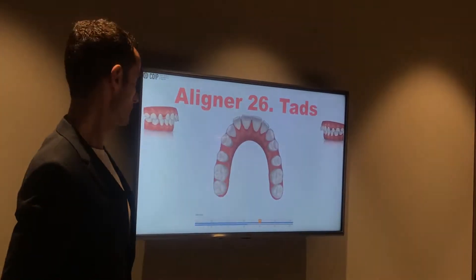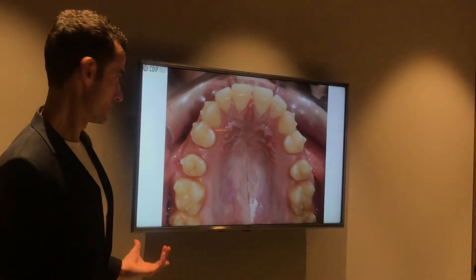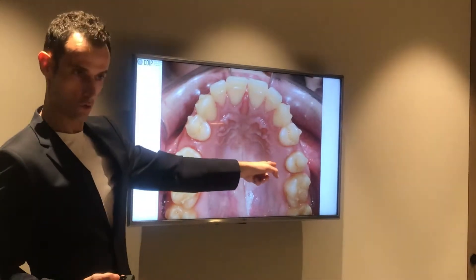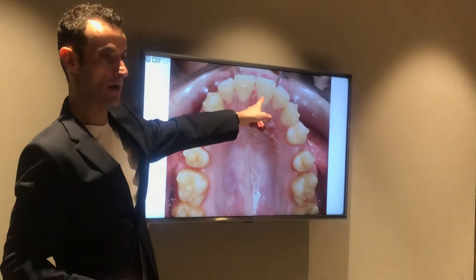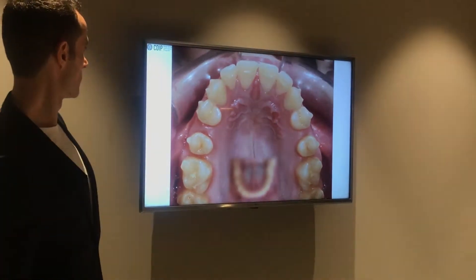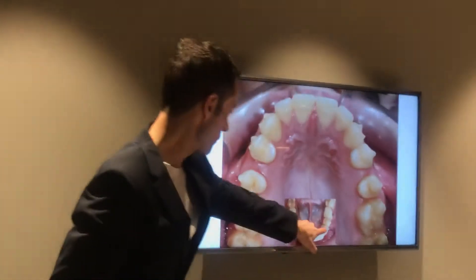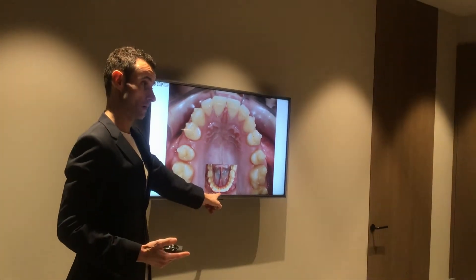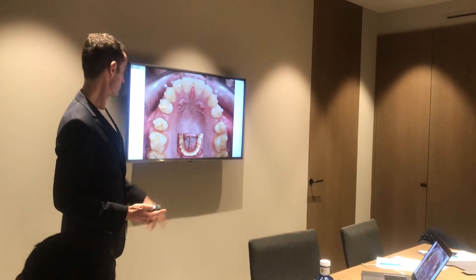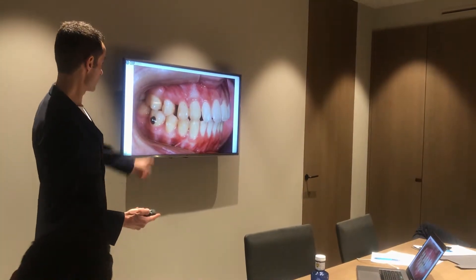How it works to distalize. Now we still have the attachments. We have a good alignment. Now we have created the overjet. They are aligned and straight. Almost to class.